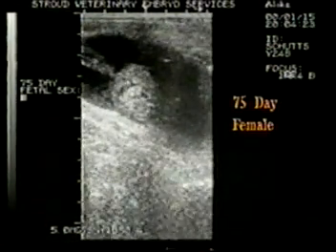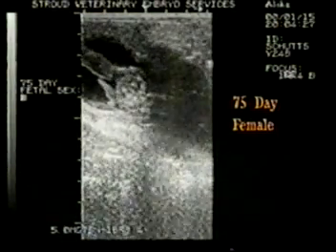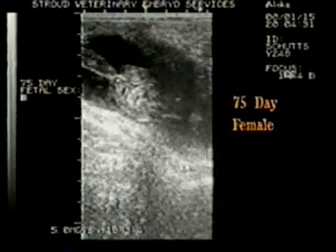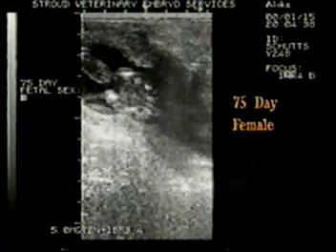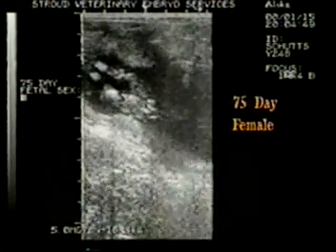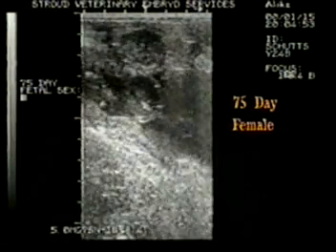As the umbilicus comes into focus at 10 o'clock, follow its attachment to the abdomen and note the lack of a sex bud in this area. There is no tubercle caudal to the umbilical attachment. As the transducer moves slowly to the rear, the female GT is isolated.